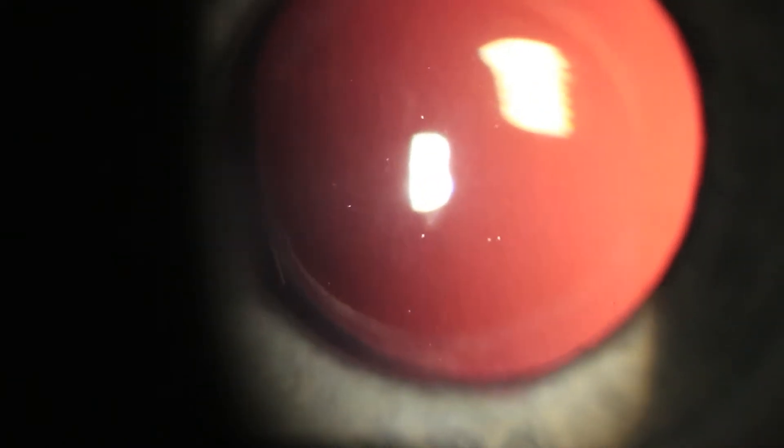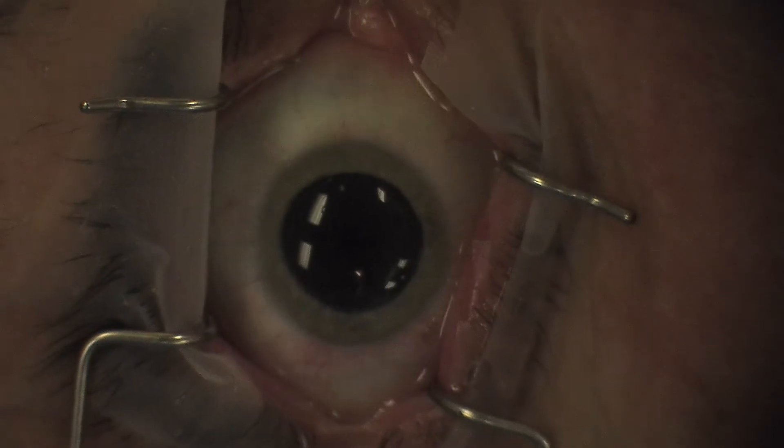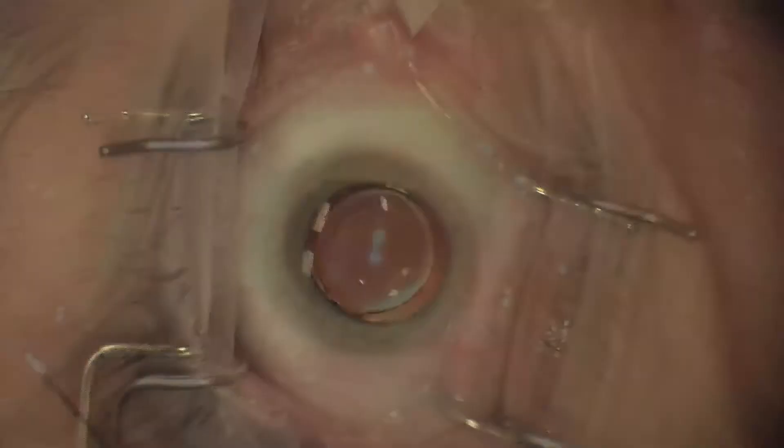This is an example of a toric T9 IOL that has rotated. You can see the alignment mark inferiorly, and we focus to the alignment marks on the toric lens and back. This lens has rotated approximately 30 degrees. We bring the patient back to the operating room and perform an ORA, which confirms that there is about four diopters of residual astigmatism.